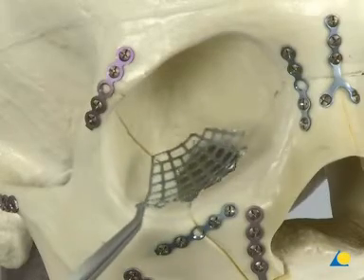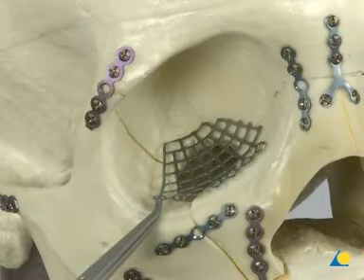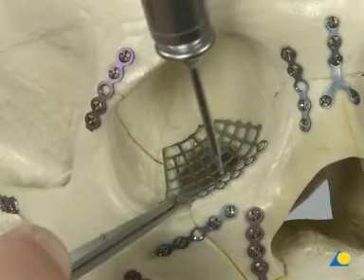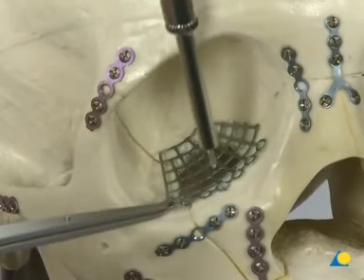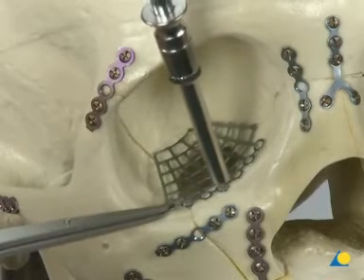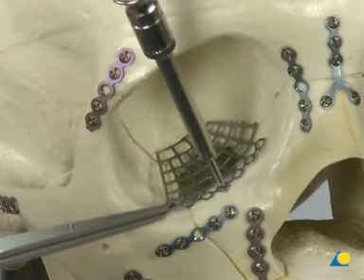All sharp edges are trimmed to ensure the protection of soft tissues. The plate is contoured to match the anatomical features of the orbital floor and rim; accurate contouring is crucial to restore normal orbital volume. In the clinic, the soft tissues must be retracted to avoid entrapment. A hole is drilled posterior to the infraorbital rim using a 1.1 mm drill bit with 6 mm stop, and a 6 mm long screw is inserted. If necessary, additional screws are inserted until the orbital mesh plate is securely fixed in place.